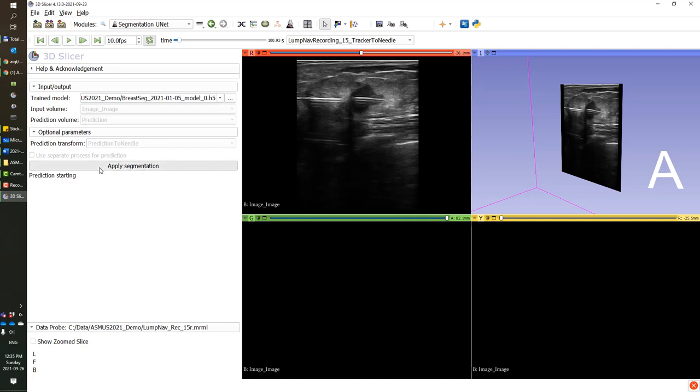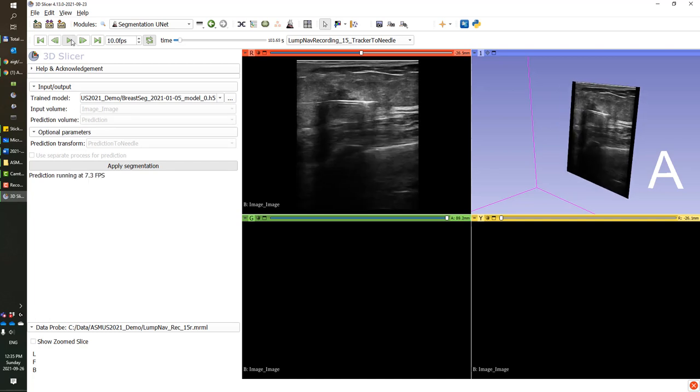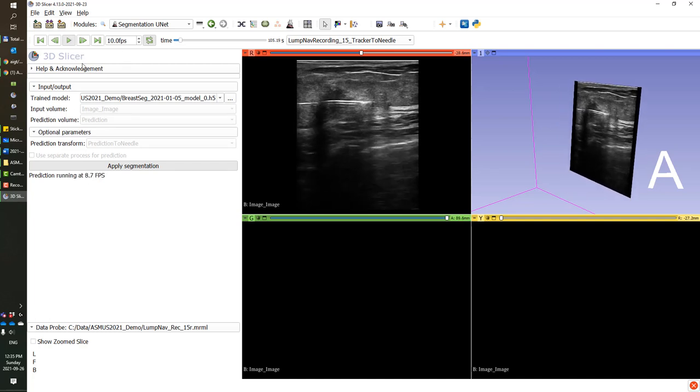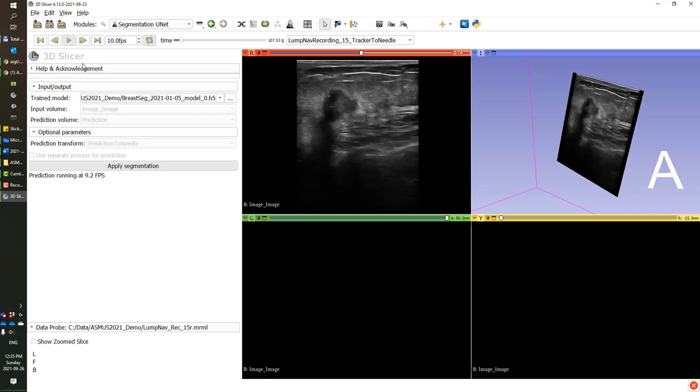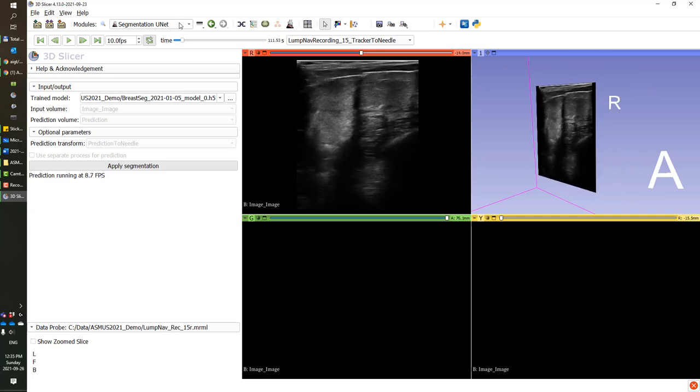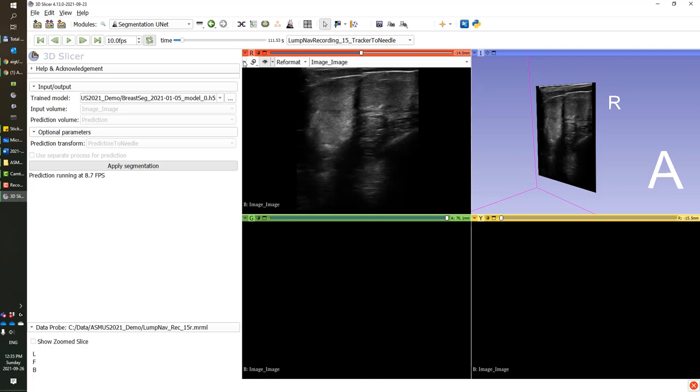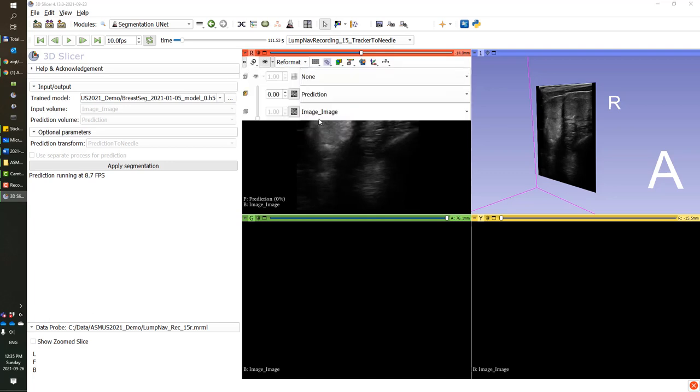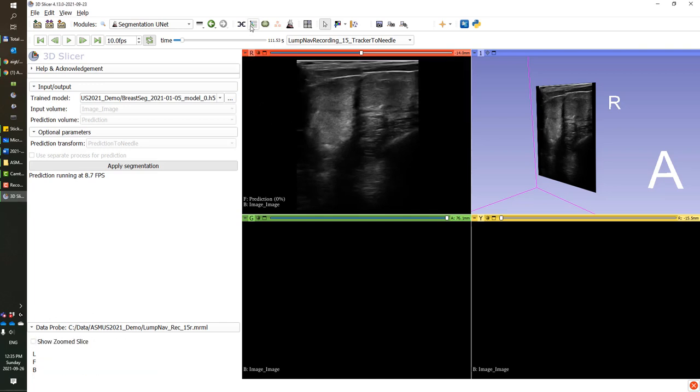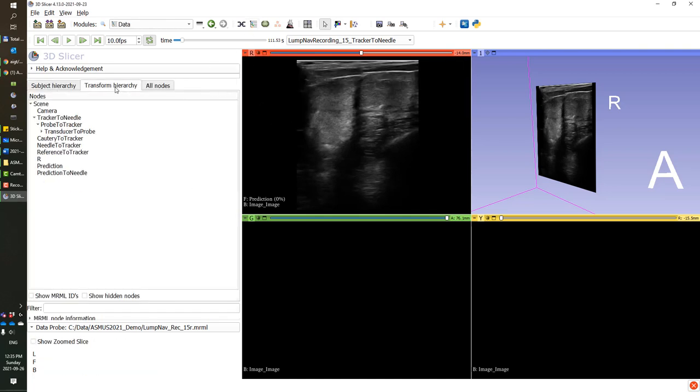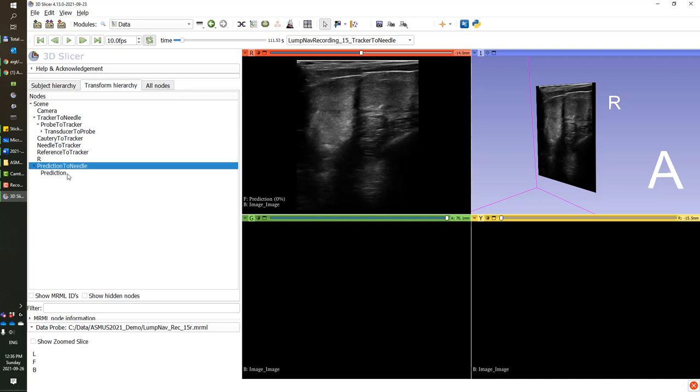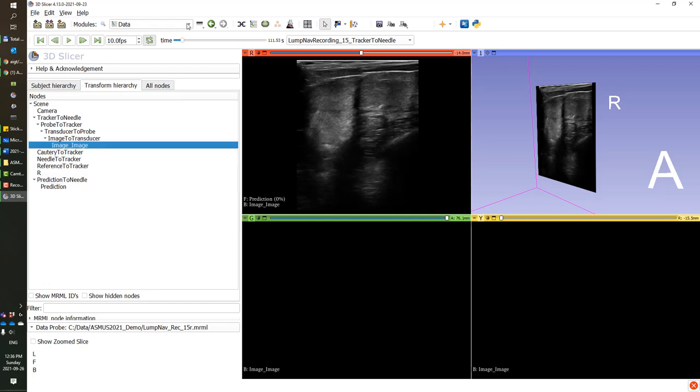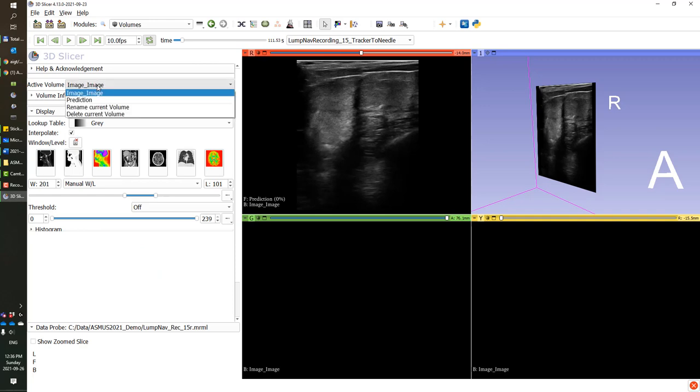The prediction volume will apply the matching transform so the prediction appears at the correct location. Now when we apply the segmentation and start replaying our ultrasound, the predictions are already generated in the background, but we'll need to visualize them. For that, we will overlay the prediction with the ultrasound images in the same view. For them to appear at the same location, we'll have to make sure that they are both transformed so they are at the correct location. The prediction to needle transform that we've just created contains all the concatenation of all the transforms on the image.